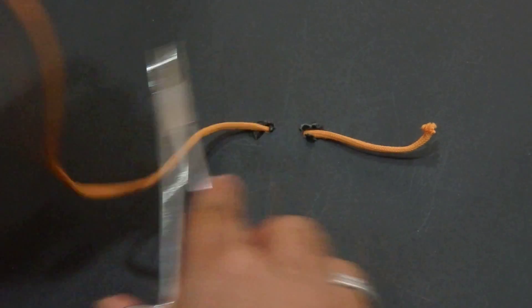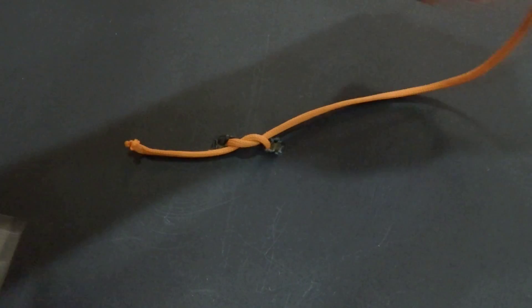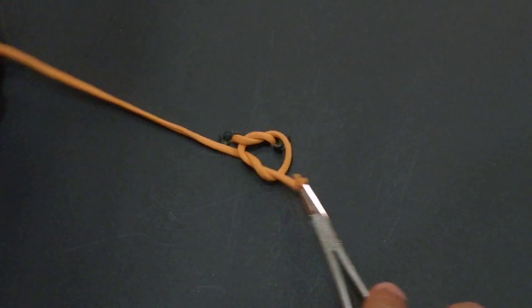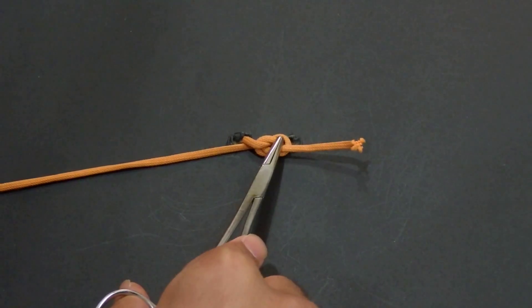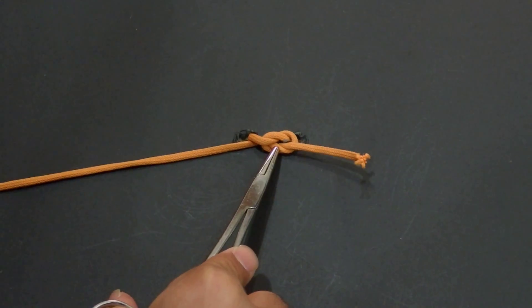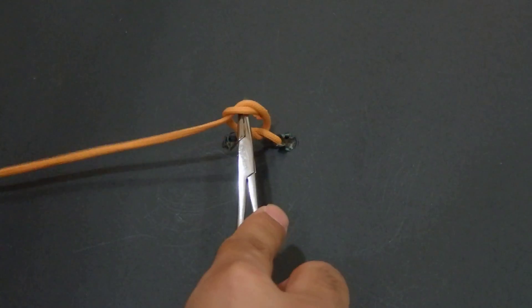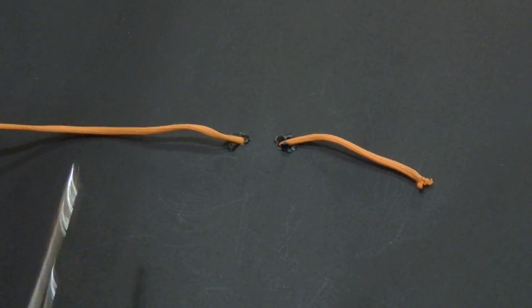To inside, to inside, and to outside — this is a square knot. What is the mistake? Some start from inside and continue from outside, like this: starting from inside, and instead of coming inside, they come from outside, and they will get the granny knot, which is one inside, one outside, one inside, and one outside.